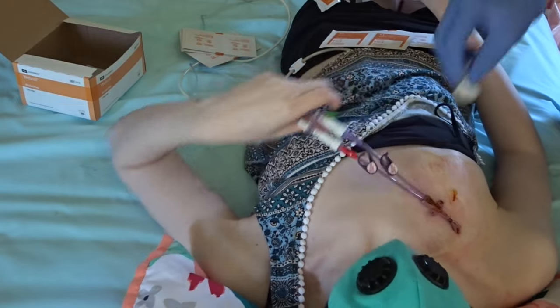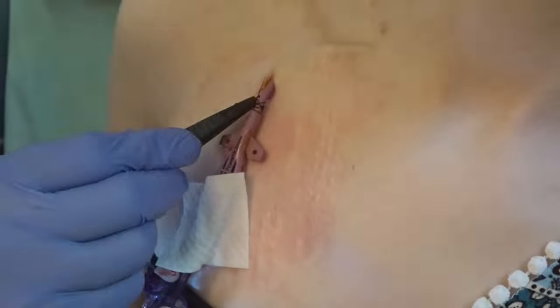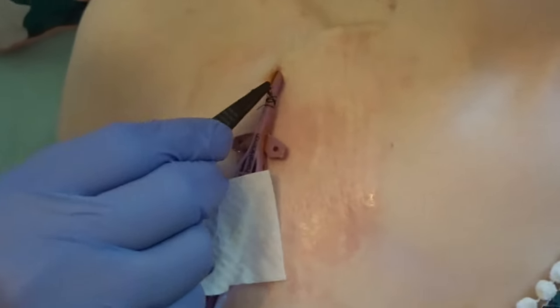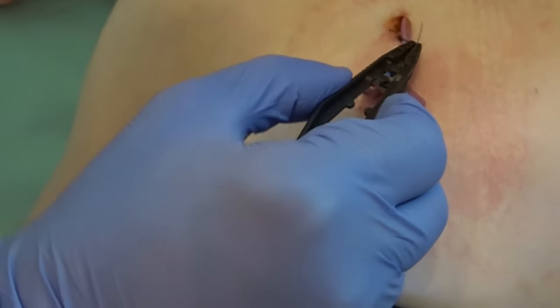Or, the patient can move the line also, providing they do not go near the area unsterile. I have a pesky stitch that likes to curl back into my incision near the line site. Mom uses the sterile tweezers from the dressing kit to prevent that from happening.